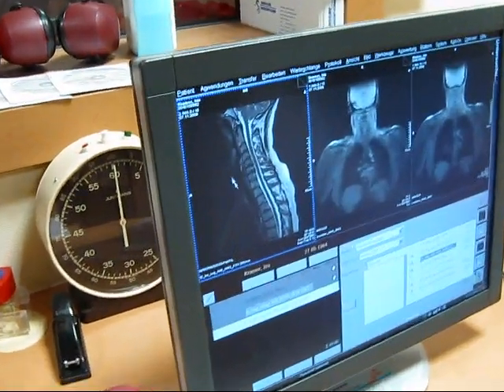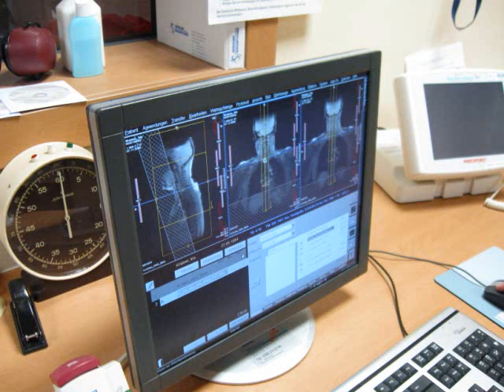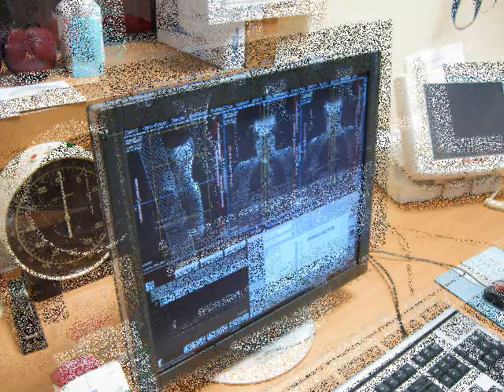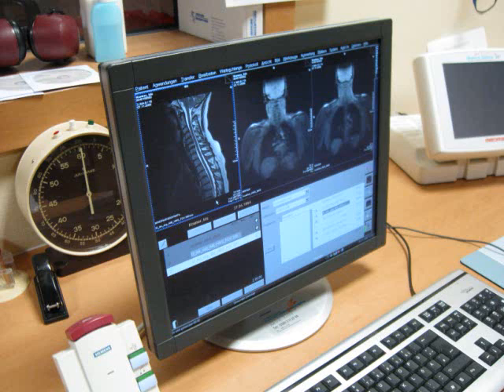As you can see, you can clearly see the details of the cervical spine. Here is a photo of the blurry scouting scan, and this is the final image of the sequence — T2, I suppose.